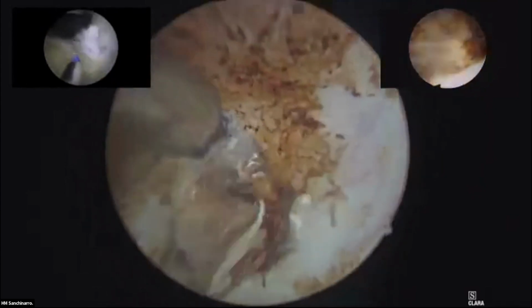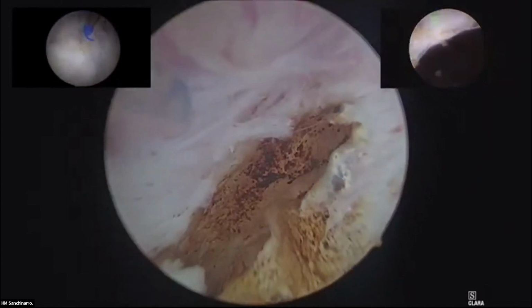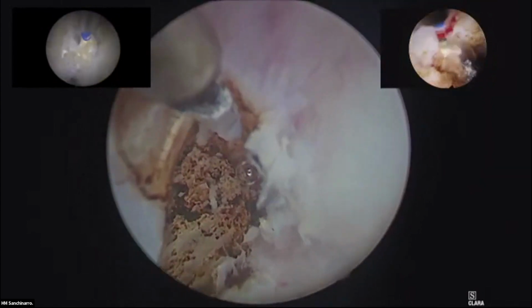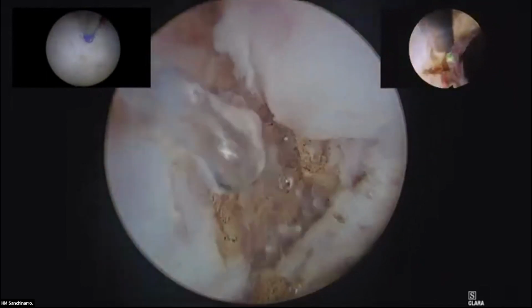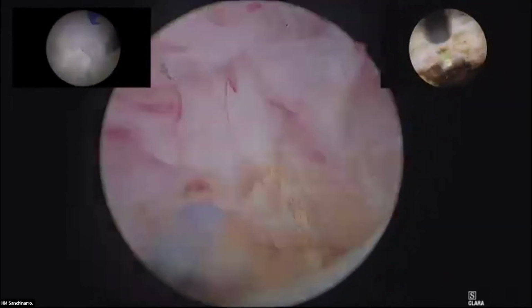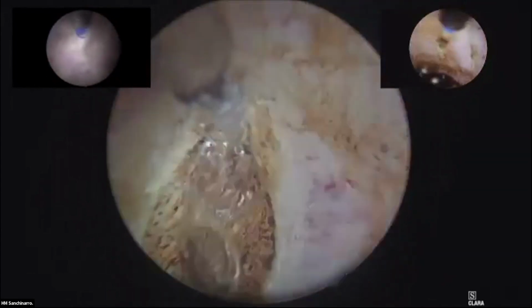You're surrounding the apical part of the prostate, and you continue with the anterior part, or you detach the sphincter now, the bladder mucosa. Actually, how do you do it? I've already detached the sphincter while I was working, like I've already done on the other side. The first part of my cut is the mucosa. When you cut the mucosa, in the area in which the urethra changes inclination because of the prostatic lobe, you have detached the sphincter, so you can do the traction that you want to enucleate the adenoma.